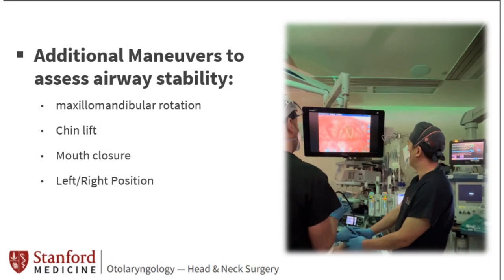The following additional maneuvers are completed to assess airway stability: maxillomandibular rotation, chin lift, mouth closure, and left and right positioning. These measurements help simulate and approximate the benefits of surgical treatment for any given patient.